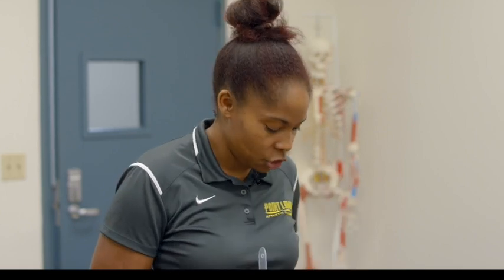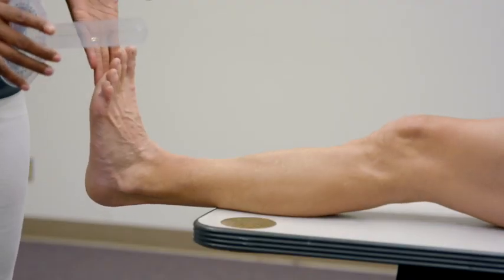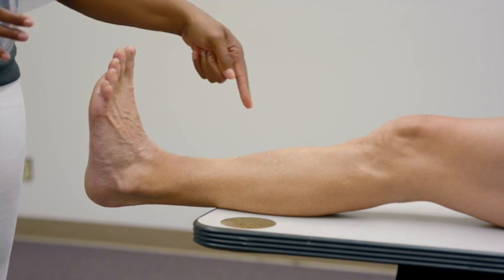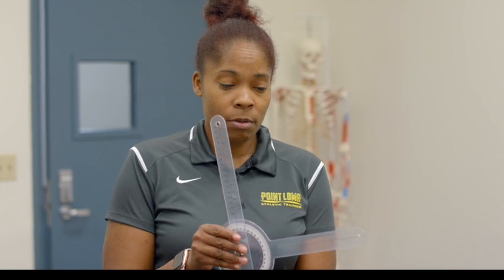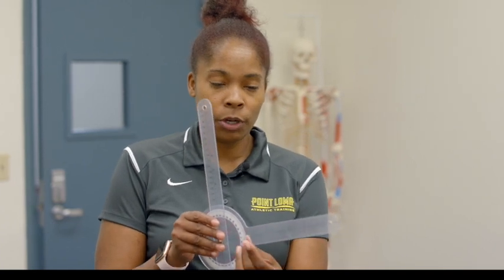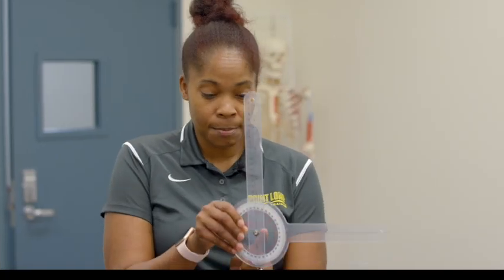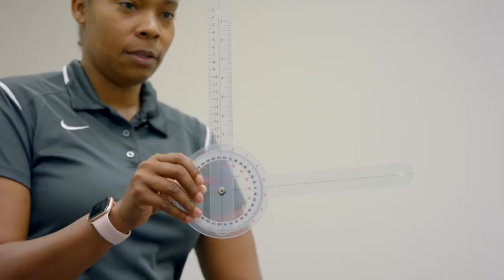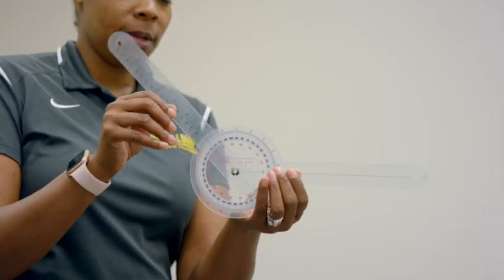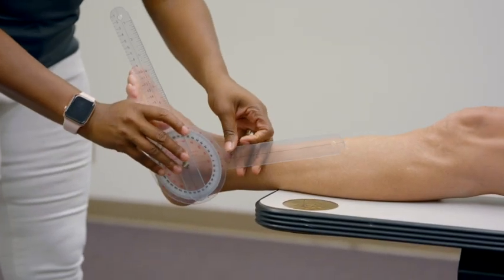The first and probably most common is dorsiflexion range of motion. Dorsiflexion is when the feet or toes go towards the shin. In terms of goniometer anatomy, the fulcrum or fixed arm is going to be on the lateral side of the limb. This metal piece should be on the lateral malleolus and your movement arm is going to move with the fifth metatarsal. Let me show you positioning first.